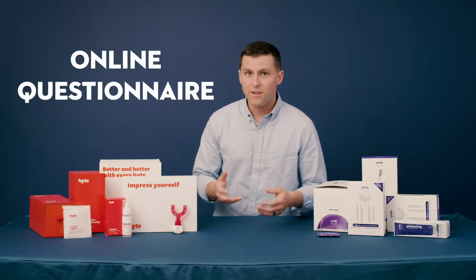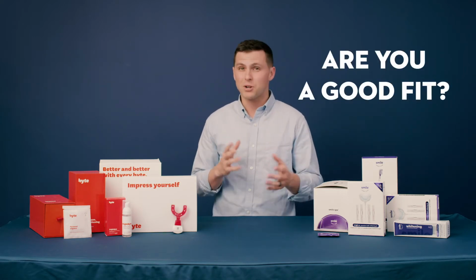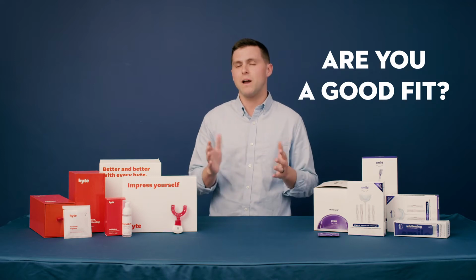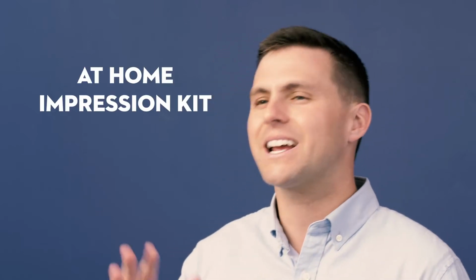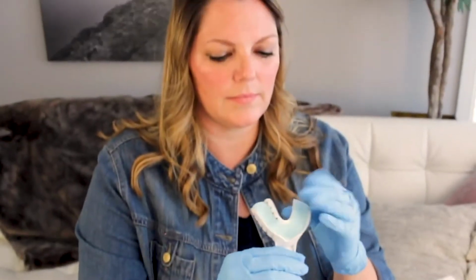Most companies are gonna ask you to fill out an online questionnaire to find out if this is even a good fit. This is actually best for someone with a mild to moderate case. Depending on the severity, you might not actually be a great fit. Now, once you determine that you are actually eligible for this process, you're gonna have to purchase an at-home impression kit. And it's gonna cost you anywhere from 20 to 50 bucks if you can find a discount. And that's where you actually take a mold of your teeth at home.